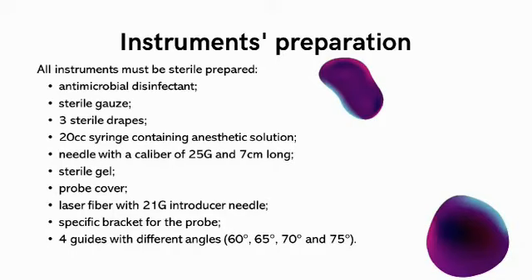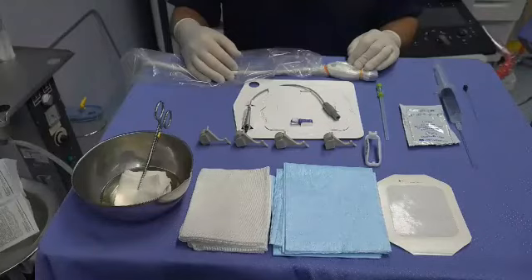All instruments must be sterile prepared. Antimicrobial disinfectant, sterile gauze, 3 sterile drapes, 20 cc syringe containing anaesthetic solution, needle with a calibre of 25G and 7 cm long, sterile gel, probe cover, laser fibre with 21G introducer needle, specific bracket for the probe, and 4 guides with different angles, 60 degrees, 65 degrees, 70 degrees and 75 degrees.